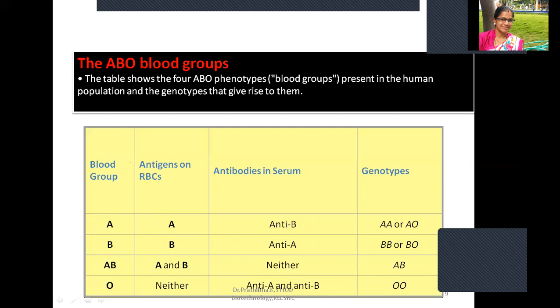Let us go through here. This is the A blood group. Here, let me write the RBC cell. Here RBC cell, and the person with B blood group also has an RBC cell. Here also one RBC and here also one RBC. If the person is A blood group, the antigens present on the RBCs are A antigens. What are these chemically? These antigens are glycoproteins. Glycoproteins mean the conjugation of carbohydrates and proteins can be seen.